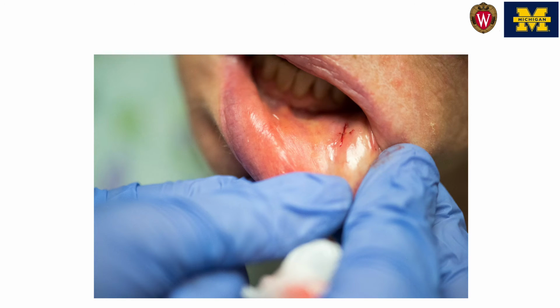Once we finished removing the necessary number of labial salivary glands, again ideally 4, but from 2 to 8 depending on the size, I put in one dissolvable 5-0 chromic gut suture. And we'll discuss how to do this shortly.